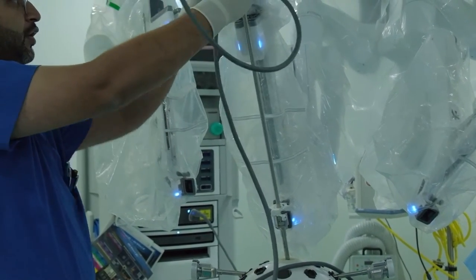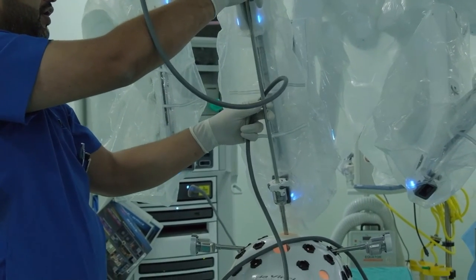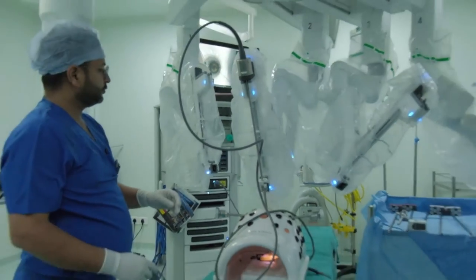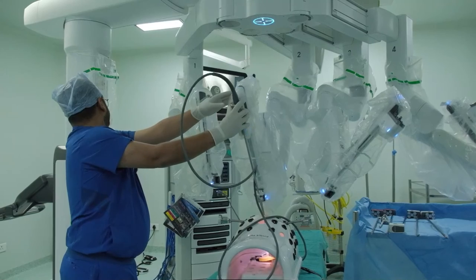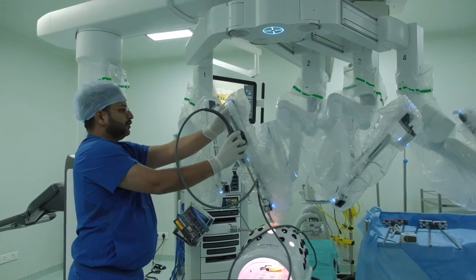This system does not require white balancing or black balancing or a 3D calibration. Now once we have installed the endoscope, point the scope at the target anatomy, then press and hold the targeting button. We push the instrument clutch and we point the scope to the target anatomy. So this is our target anatomy here.